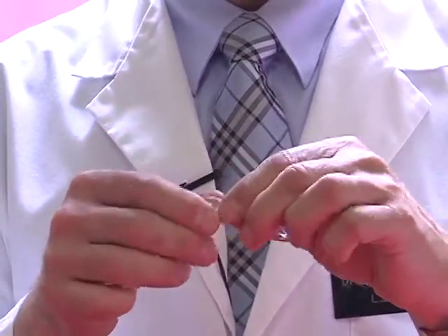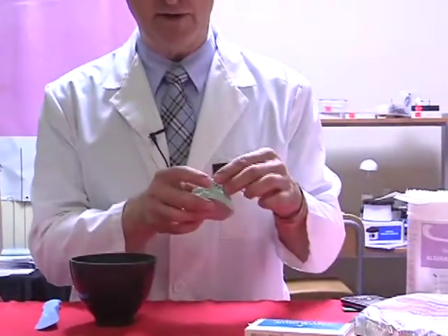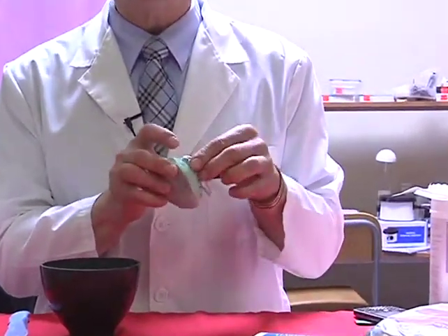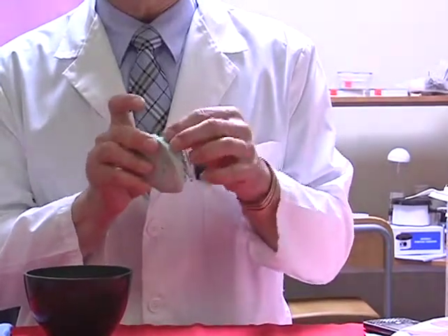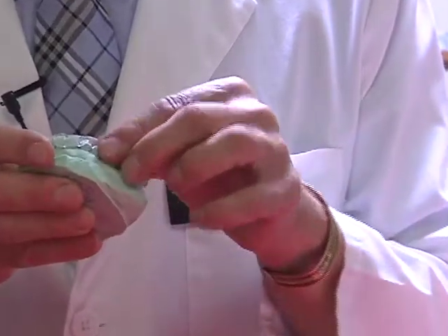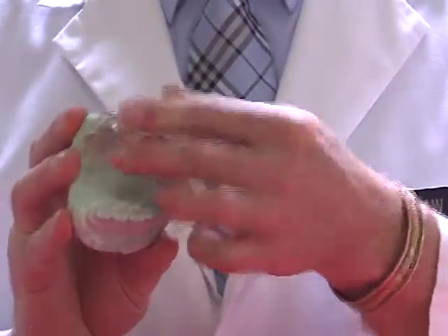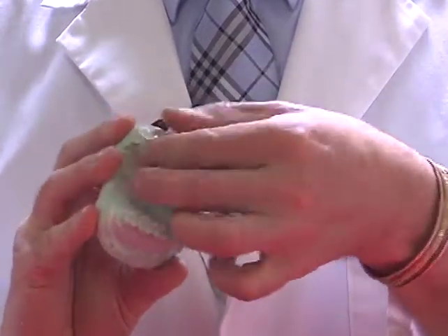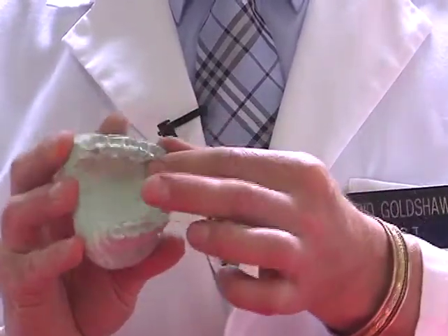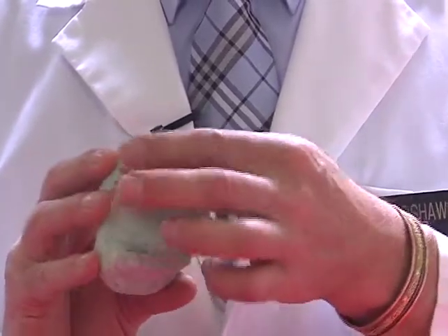At this point, I would roll it out into a small thin sausage and adapt it down directly into the patient's mouth, over the teeth. All we'll be using is our gloved fingers with a light pressure, placing it down over the teeth. As I'm adapting it down over, like so, with slight pressure, the patient just feels a nice warm material. It's not hot, it's just warm to work with.